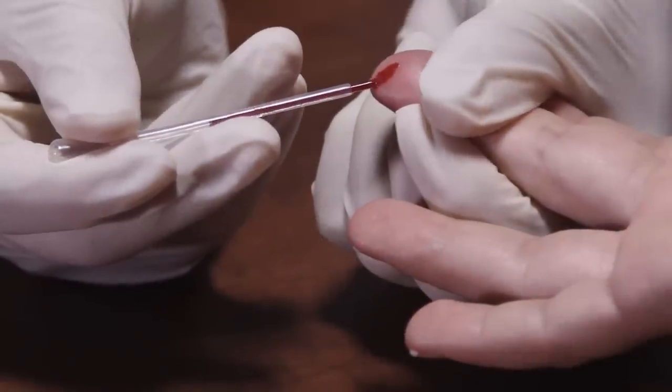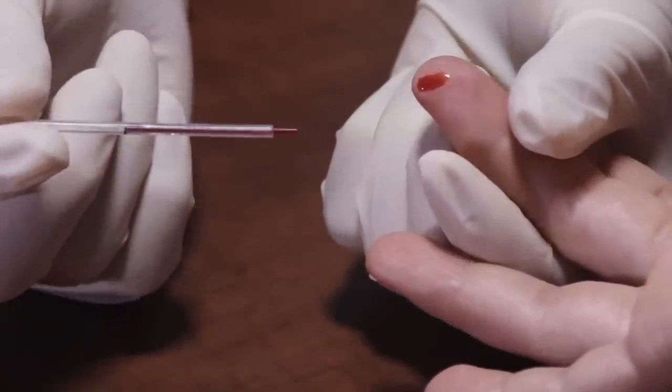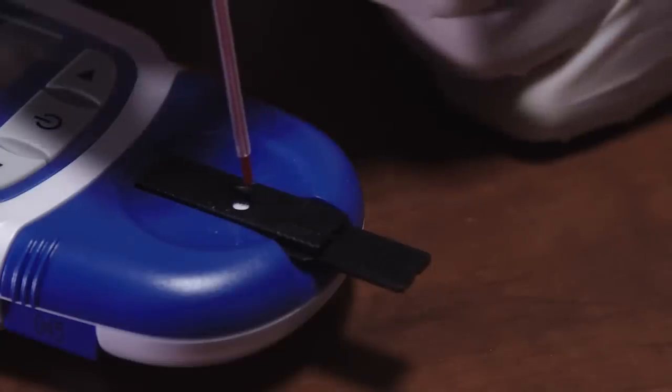Once the sample fills past the black line indicator on the transfer tube, squeeze the bulb to expel the sample onto a test strip or cartridge. Discard the transfer tube in an appropriate manner.